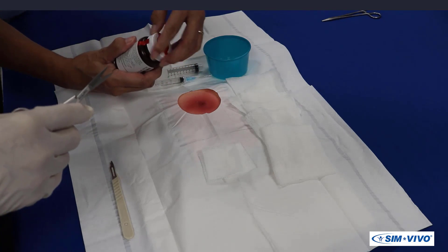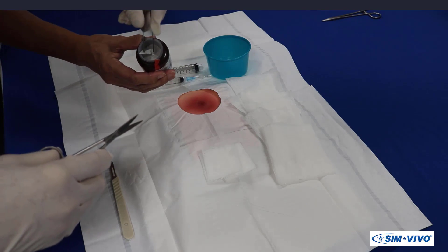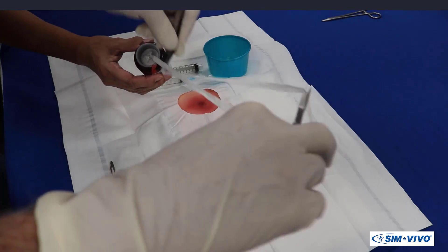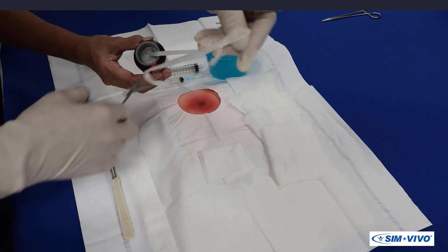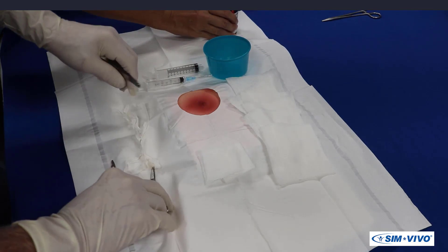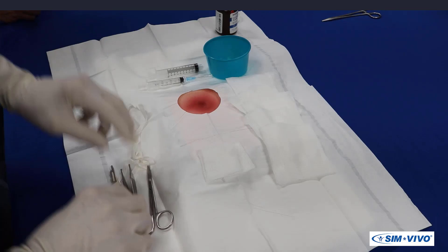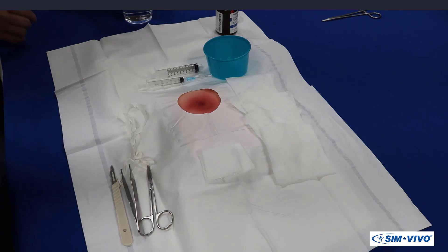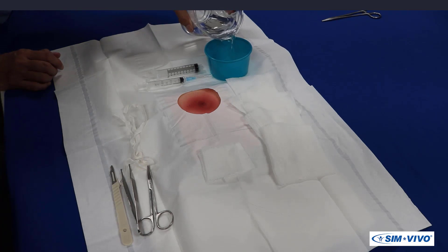After removing the cap from the packing strip container, your assistant will present you with the end. You should grasp this with the forceps and pull about 12 inches onto the sterile field. The assistant will recap the bottle and then pour some irrigation fluid into the procedure bowl. In the clinical situation, this will be sterile saline.